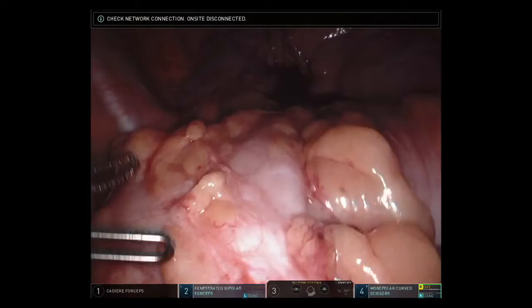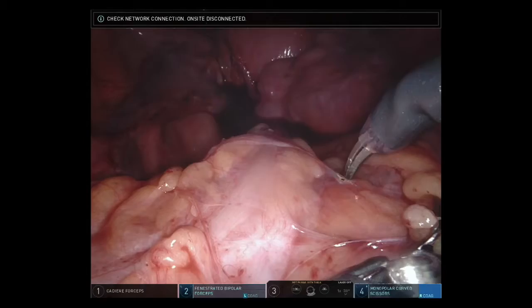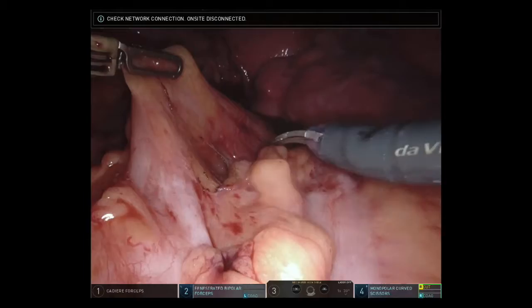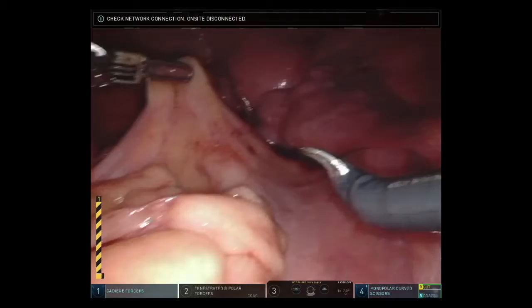It was difficult to tell, given the multiple inter-loop adhesions, where the original iatrogenic injury had occurred that resulted in the need for a Hartmann's procedure. We used electrocautery to free up the adhesions between these limbs of bowel in order to help straighten out the colon and to facilitate eventual endoscopic evaluation of the distal bowel.